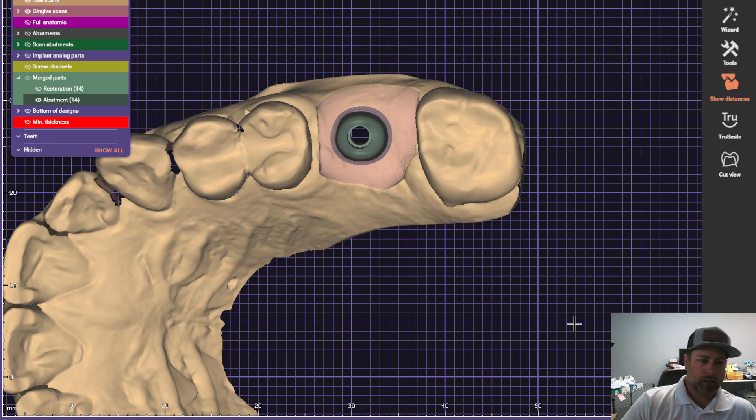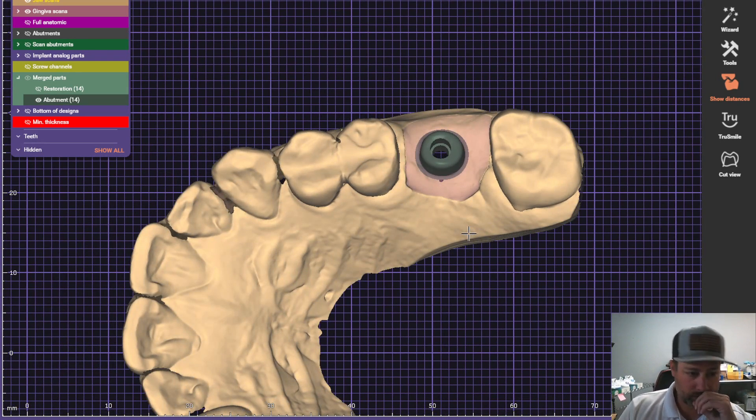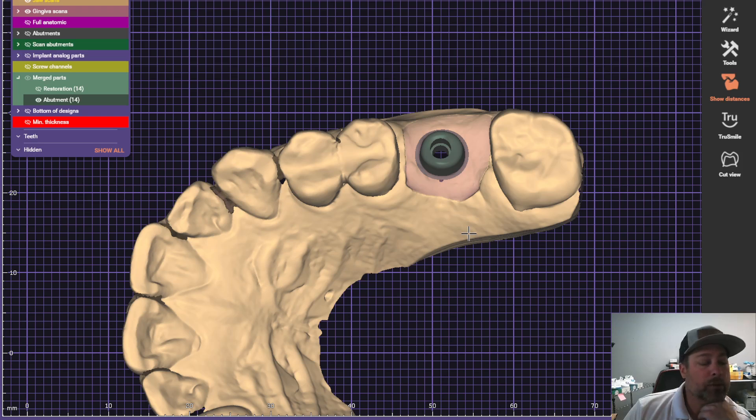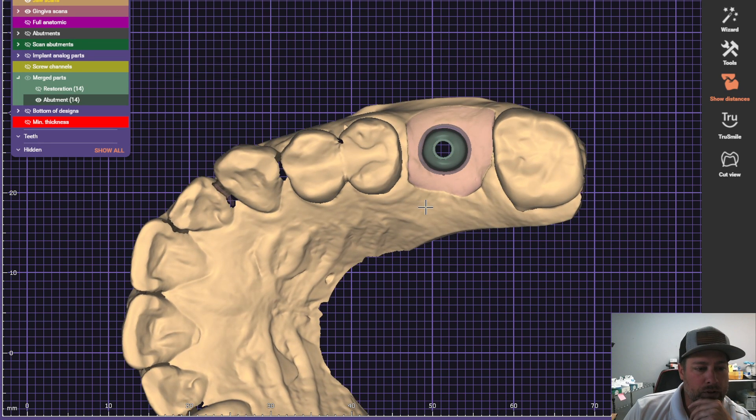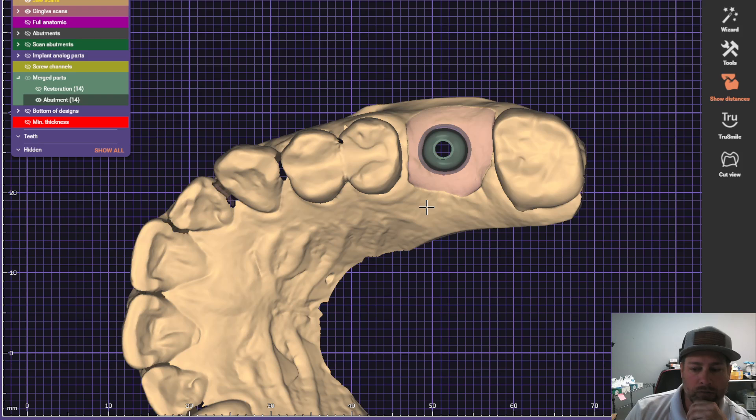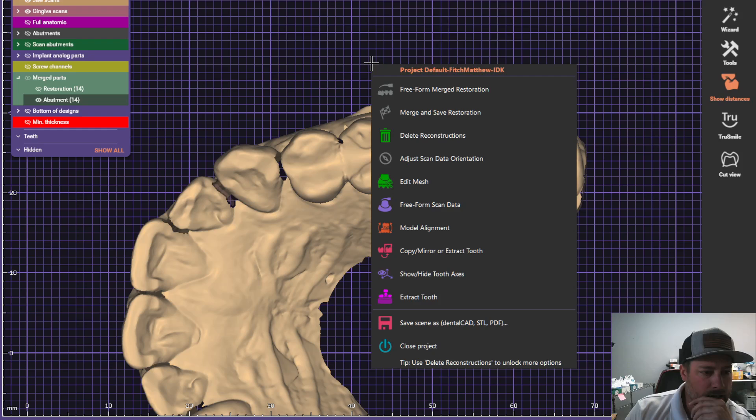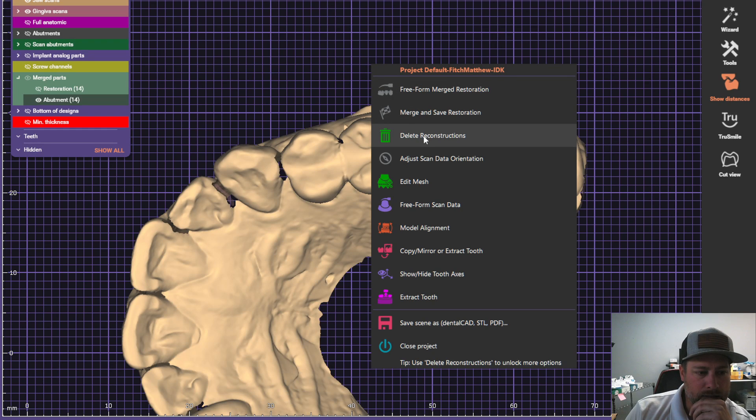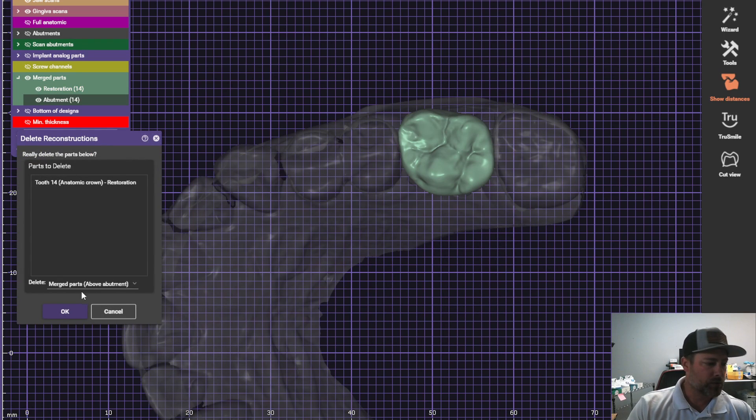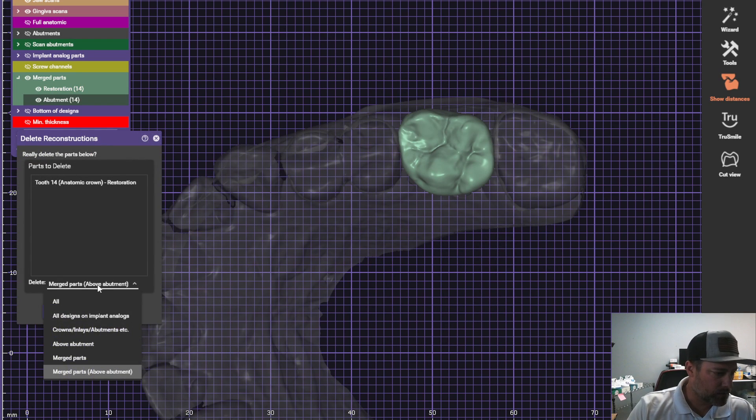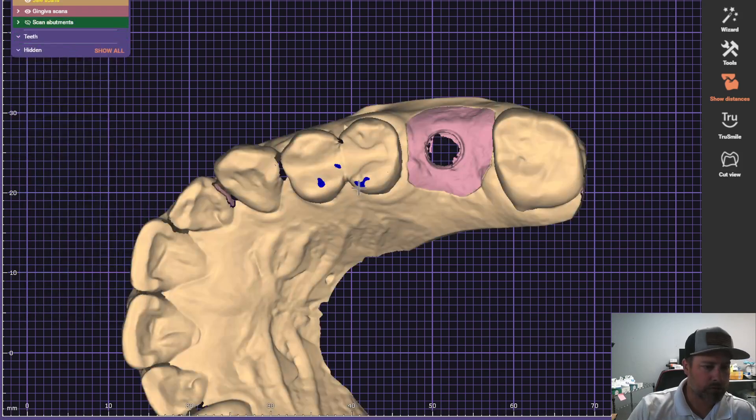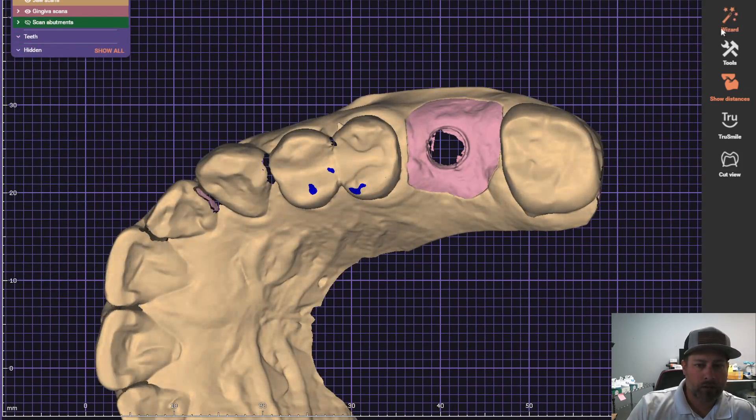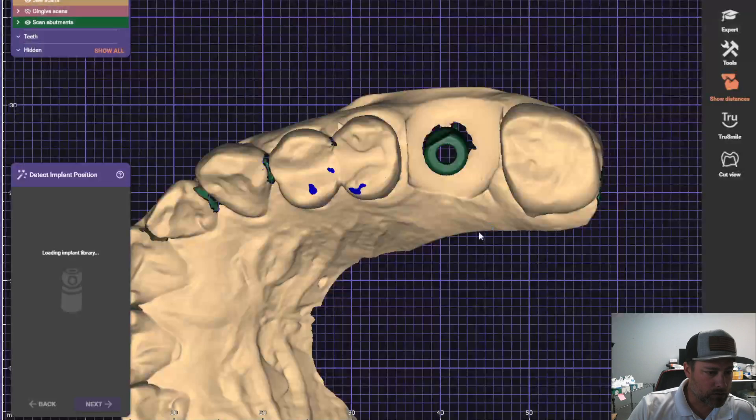Alright, I'm going to show you how I designed my custom abutments and manually punched the screw hole through the crown to make it a screw-retainable. We're going to start back at the beginning and I'll show you how I designed my abutments and crowns. So let's get started.